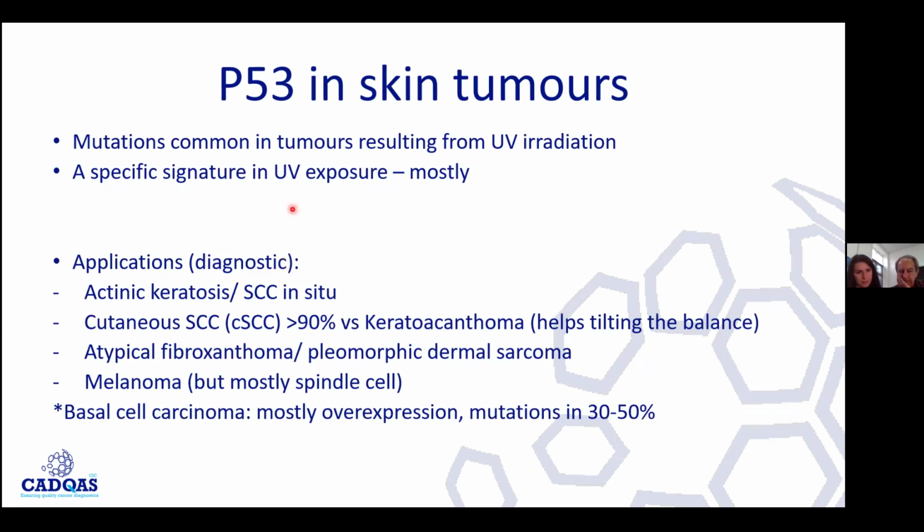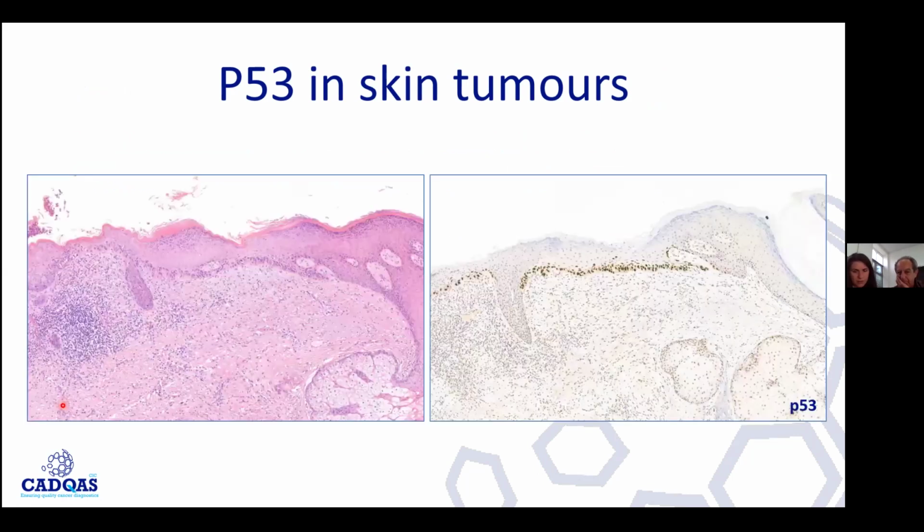And then skin tumors. Of course, with P53, one of the injurious elements is UV exposure. In squamous cell carcinoma, for instance, the P53 mutation is very common, and in all the sun damage related lesions. This is another example of basal pattern, isn't it? In an actinic keratosis, we clearly see dysplasia here. Isn't that interesting? You see that there is a gap in the follicular infundibulum. Yes, but not always, because sometimes you see it all around.